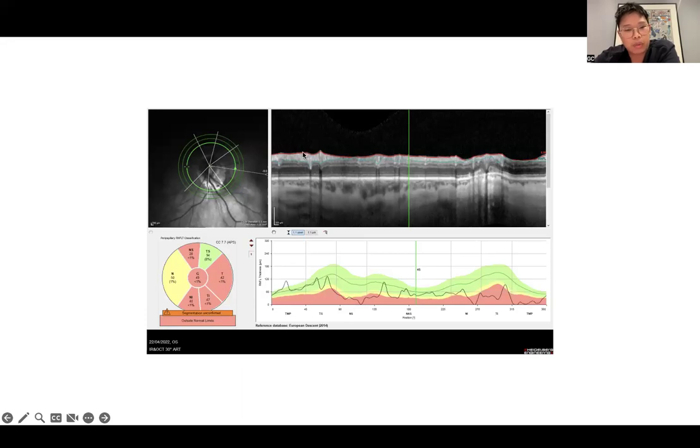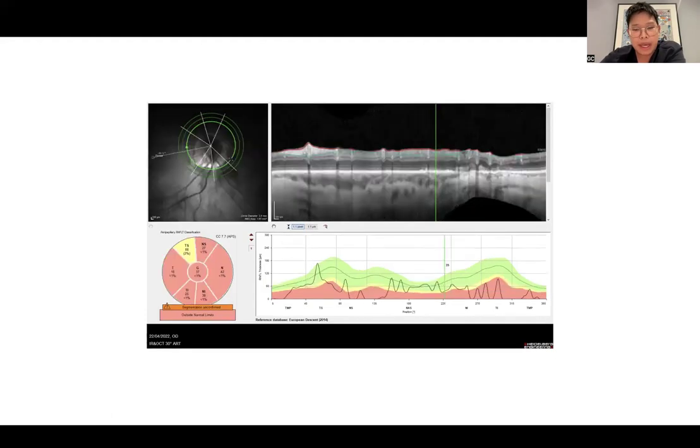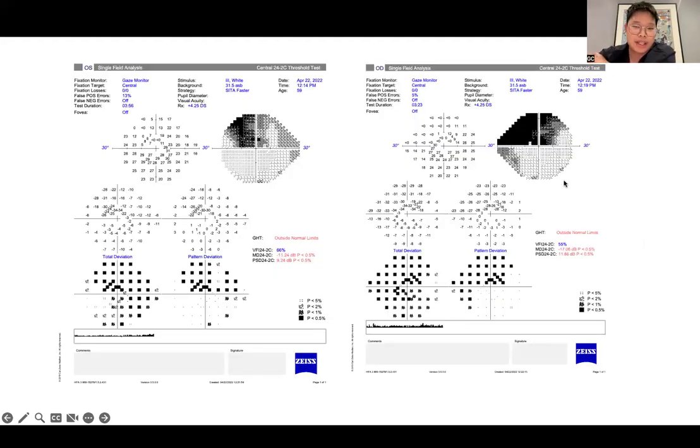And so what wasn't picked up was that he'd had actually significant glaucoma related to both the underlying myopia as well as the pressure rise related to his ICL implants. So here you can see significant thinning, especially of the inferior neuroretinal rim. Similar picture in the right eye with diffuse losses. And his visual field showed significant scotomas related to the areas of optic nerve degeneration.